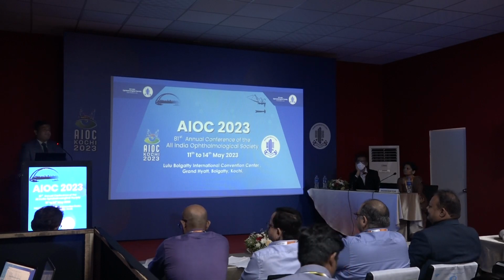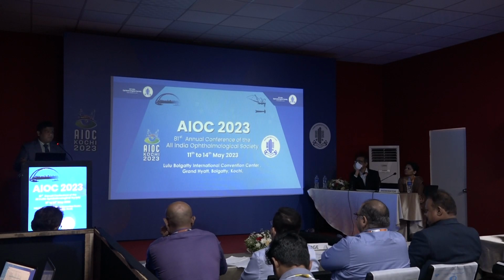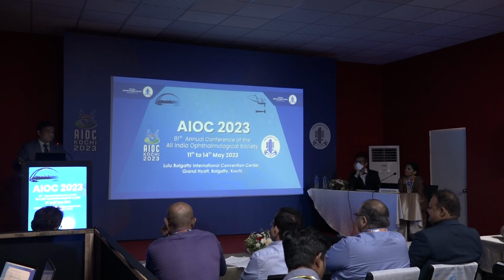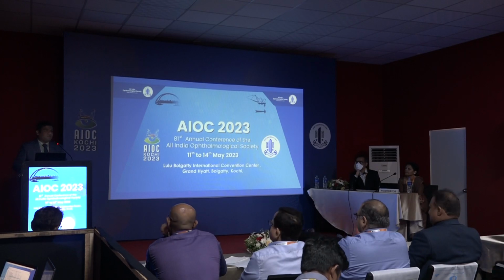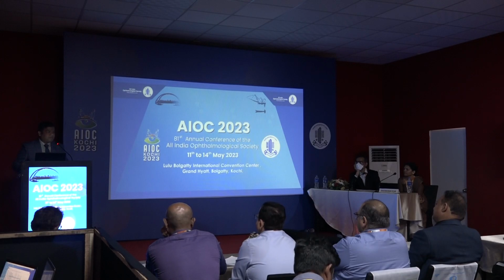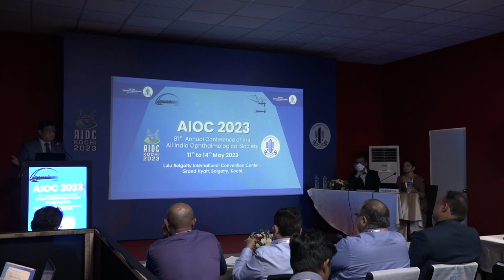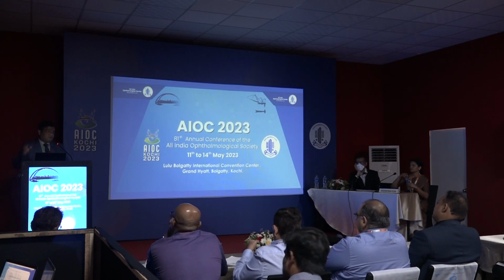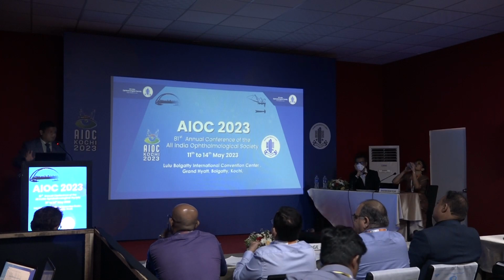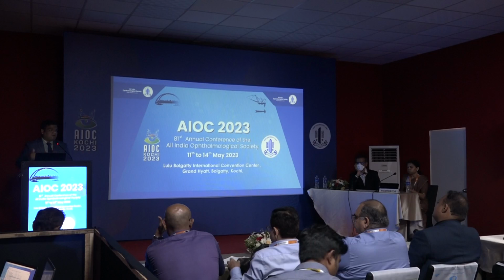So it doesn't really help that much in the treatment, but we can actually record that it's present. Later on, DME is a progressive disease. The DME is not going to resolve usually. Most of the patients are diabetics, and it keeps progressing. So when we see the patient again at a later stage, we can know that there were some peripheral hard exudates present, which have now increased and the macular area has now been involved.